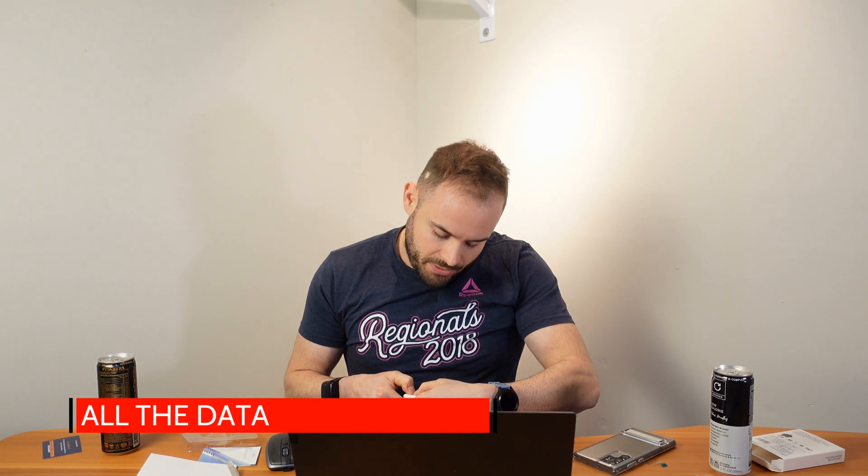Now that we've been recording for a while, I'm going to stop this manually by holding the Enter button and the Down button together. We are all stopped — it took a little bit more than expected. Now to get it loaded onto the computer, we need to open the battery compartment. They recommend replacing the triple-A battery with a fresh one every time you use it. Press down on the SD card to pop it out — it takes a little bit of a nail to get in there. It's a 16-gigabyte card. Now we'll put it into the card reader and load the system.